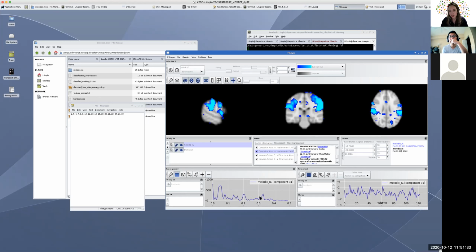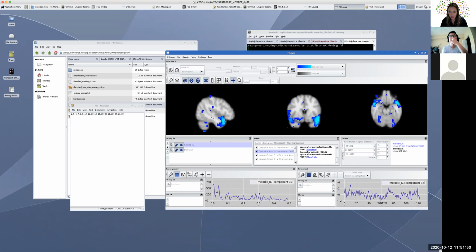If it is mixed and it is only in these higher frequency regions, then I would for sure put it as noise. But again, when it's mixed with signal and noise, go on the safe side. So I would keep this one in. Okay, so I think this one's almost done.